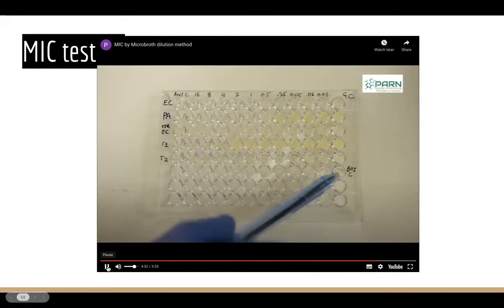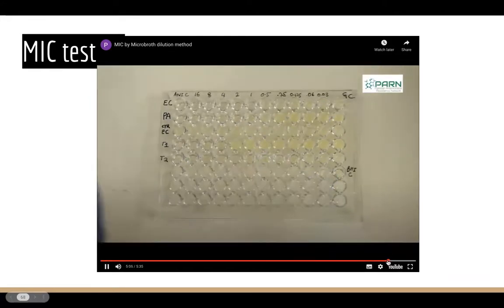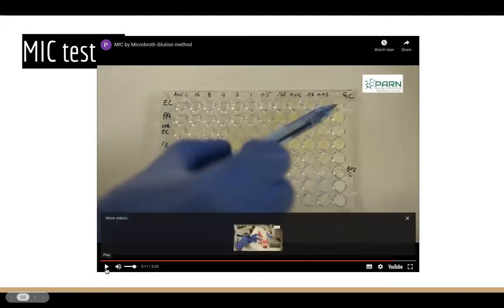Sterility control and antibiotic control should not have any growth. The organism MIC should fall within the recommended range. So you've also got to make sure that the organism itself falls within the recommended range. If you find that for some reason your control organism is not within the expected range for the antibiotic, where it's not a new antibiotic and it's known, then you know something's up, and you should repeat the result. You should repeat the results anyway.